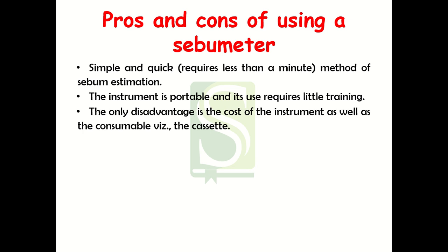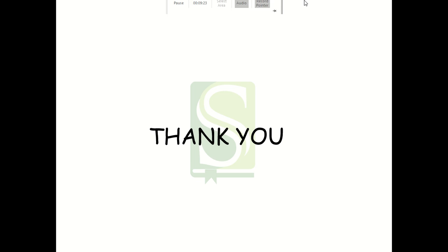The disadvantage is only the cost of this instrument, as well as the consumable, that is the cassette. The cassette is also very costly. So this is the only disadvantage of this method. So this was all about Sebumeter.